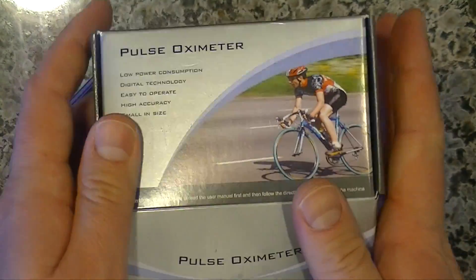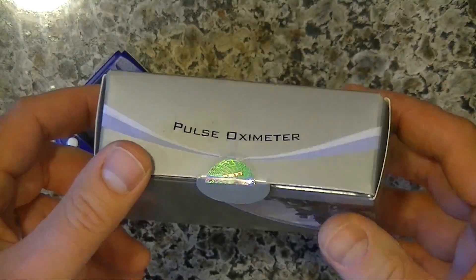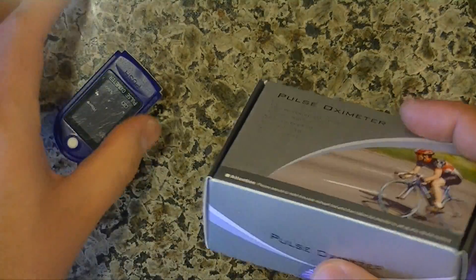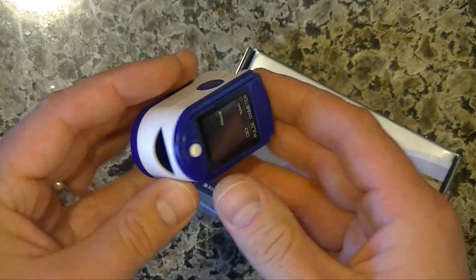So anyway, it's great. If you need to monitor your blood oxygen or your pulse, it's instant and it's accurate and it's cheap and it's quality. So all around win.